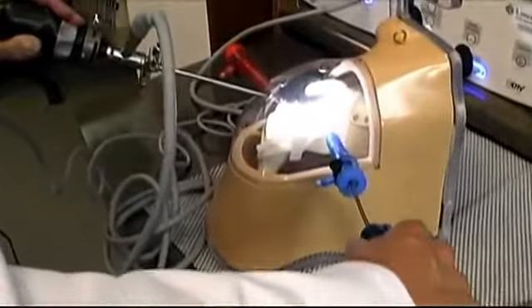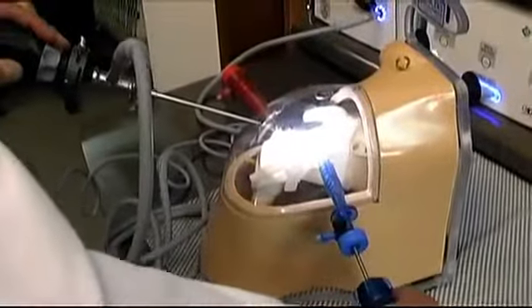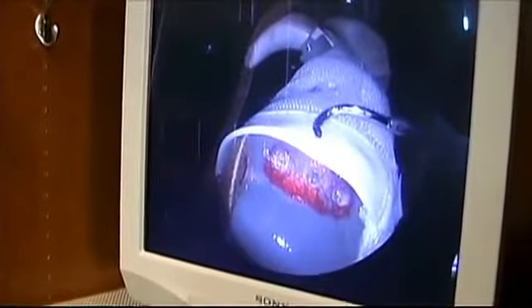Now, the instrument itself is then placed through the cannula and into the shoulder itself. Now, we don't watch it from outside the shoulder, we watch it from this screen that you see here inside the shoulder. This is a replica of what is actually a rotator cuff, which is the tendon and muscle unit that so many of us damage from time to time, but it's essential for helping us have a pain-free use of our shoulder. When this cuff, which is a sheet of tendon right here, gets pulled away from the bone below it, what we do when we repair it is we stitch it back to the bone with these instruments.